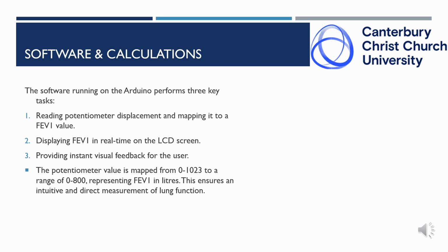Furthermore, additional calibration will be done using standard FEV1 values and calibrating with a vitalograph to ensure that the values displayed coincide with the volume of expelled air, in turn ensuring accurate data recording and patient diagnosis.